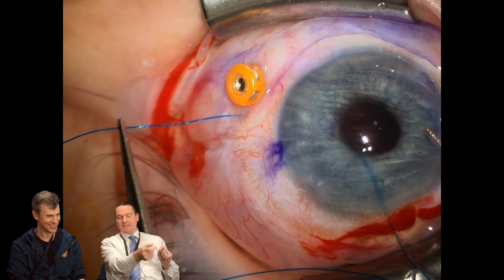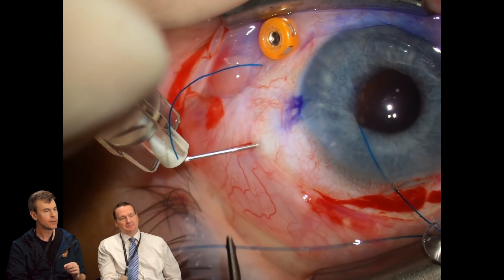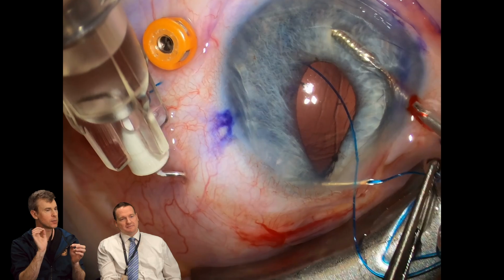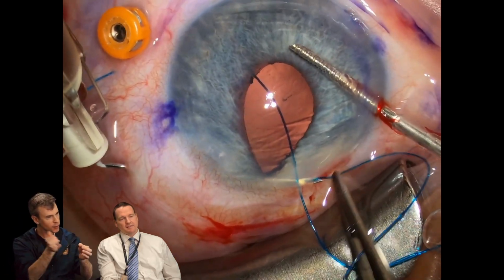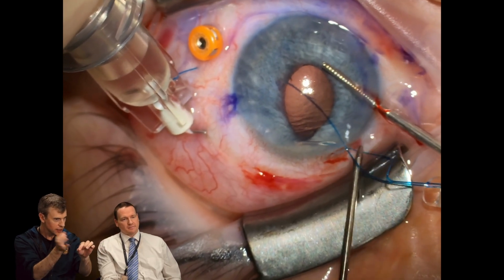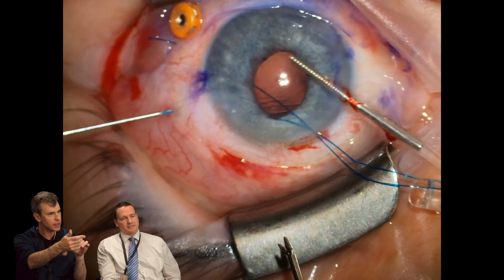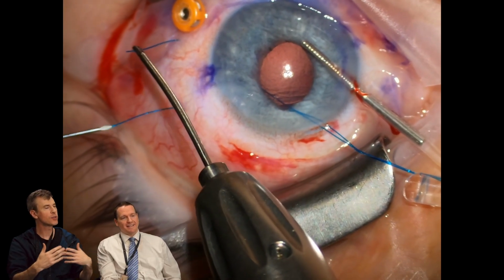Very nice. Is that Prolene, that blue Prolene? Yes. It's a 6-0 Prolene, which is pretty stiff, but still pliable enough so I can move it and get it into the needle. And then I basically thread it far enough so by the time I pull out the needle, it's already through the sclera. So think of it like feeding it through the sclera while I'm pulling, and then as it comes out, you can see the needle almost removes itself around the suture.